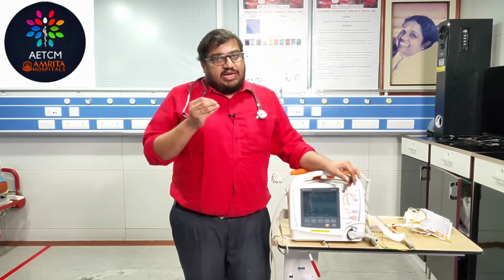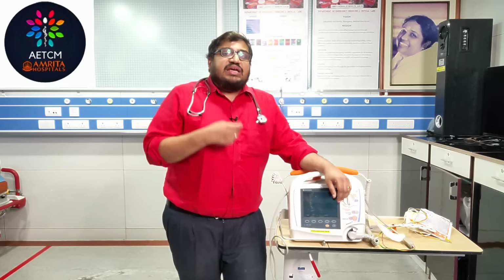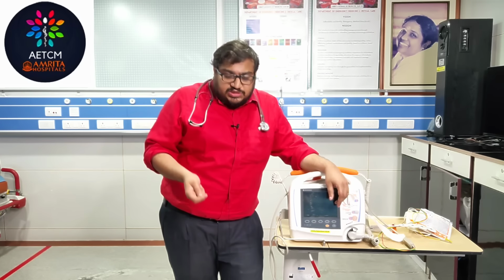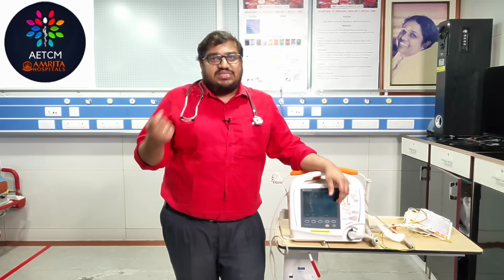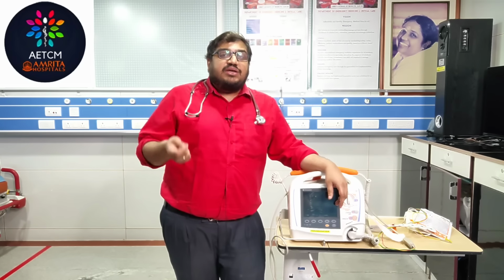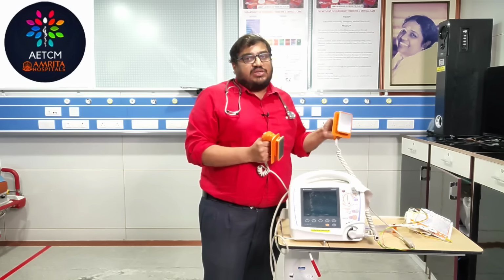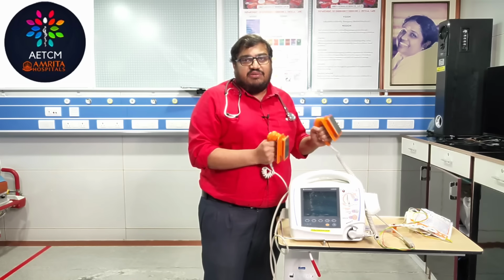So first step, you have switched on the machine. You have selected the energy. The next thing, before touching the patient, you have to make sure that no one else is touching. Before delivering the shock, make sure that no one else is touching the patient. Now you have selected the energy, but this machine is not charged. These paddles are not charged. They don't have any energy.